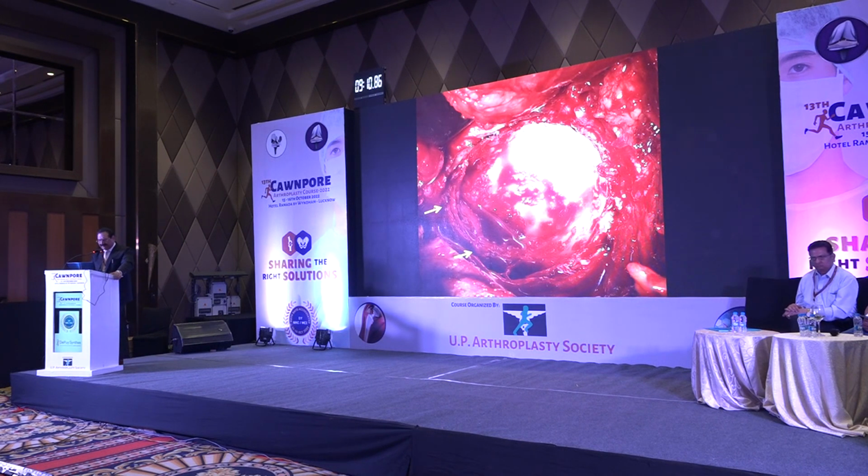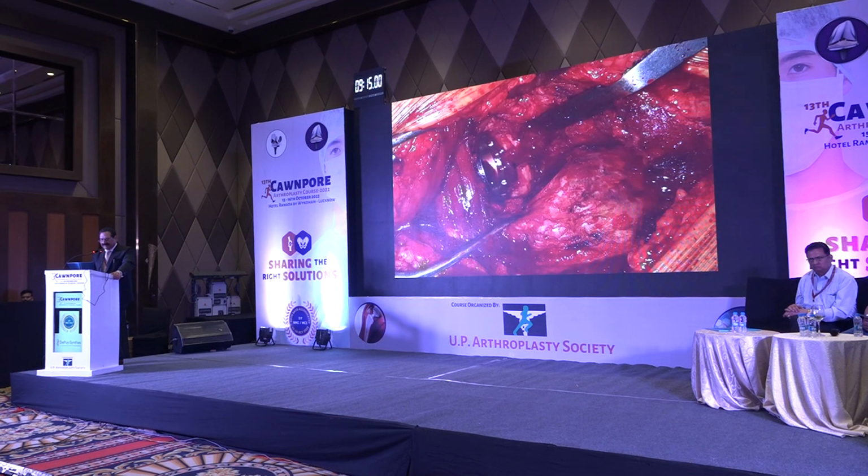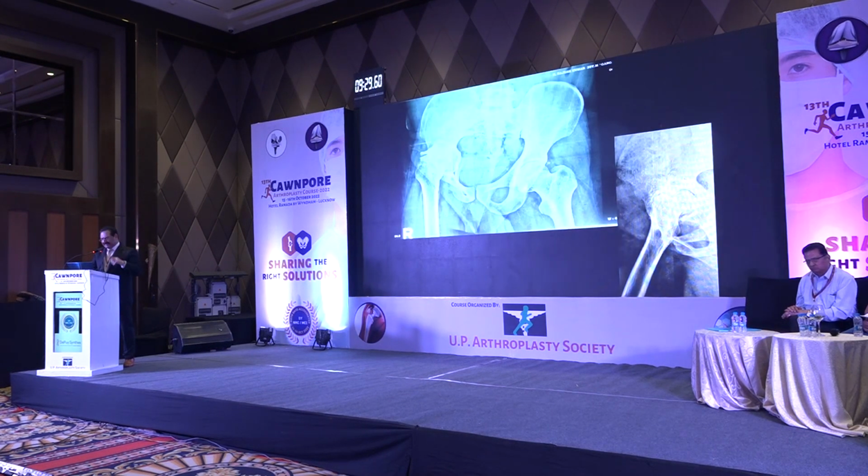And just a few examples. This cup is parallel to the TAL, and this one is slightly inside, a slightly closed cup. In a few cases, you will need mental templating, knowing these parameters. You have bony margins available, you have the TAL available, you know what you are doing. In one or two difficult cases, mental templating might help you.